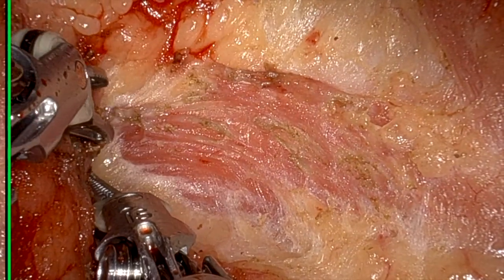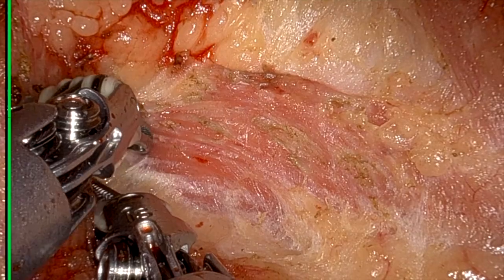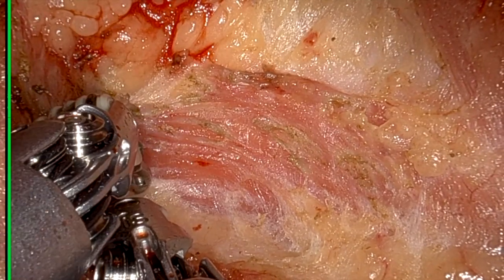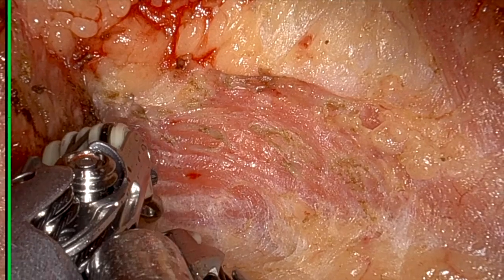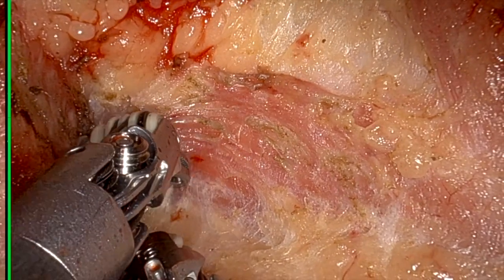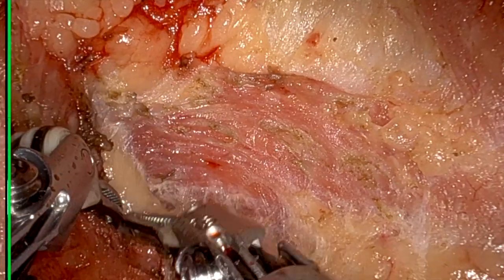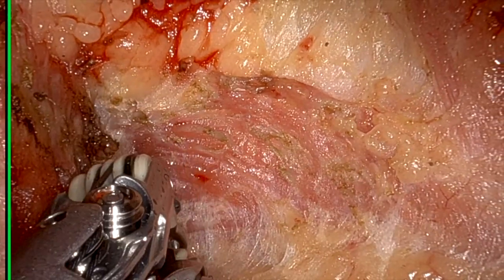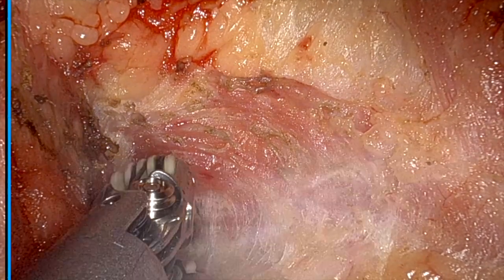The idea is to locate the mandible. But mind it, we don't have tactile sensation in robotic arms. So for this purpose, I am totally relying upon my assistant who will help me in locating the mandible. I will show how. Already told you about the position of patient, but one thing I left, which is neck extension. As in open surgery, here also we give neck extension.